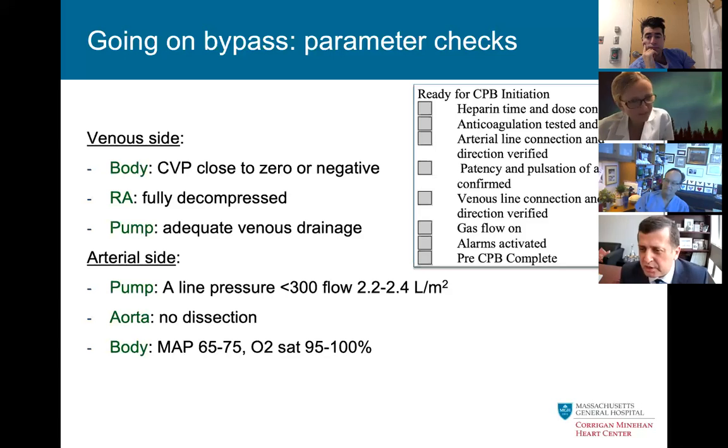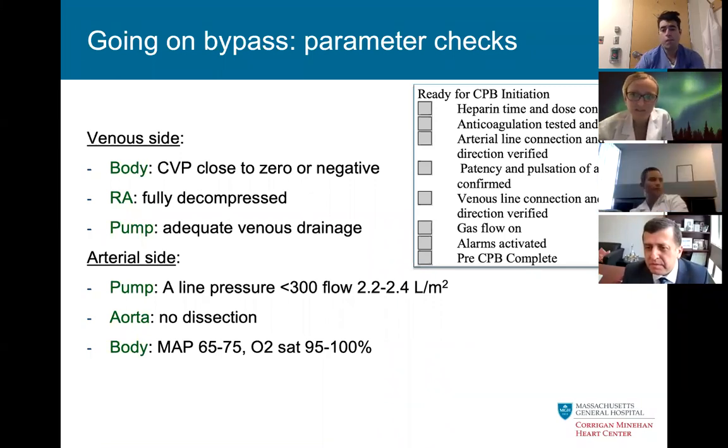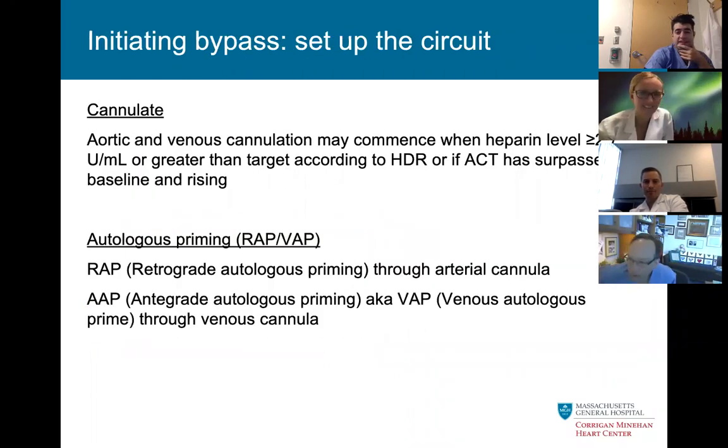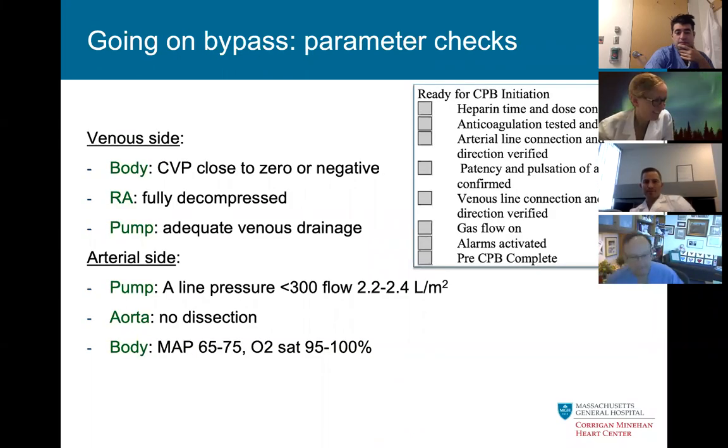Well, you might get some clots, you might send some clots to the brain, but the patient is not going to die immediately. What's the difference? Well, you're solely relying on the bypass machine to support the patient. So if it goes down... It's in your picture, Antonia, of the circuit. What's present in a bypass circuit that's not present in an ECMO circuit?